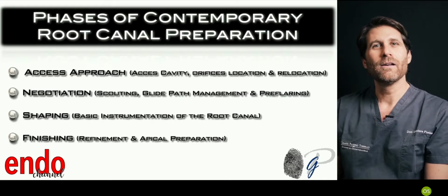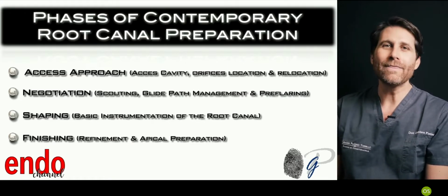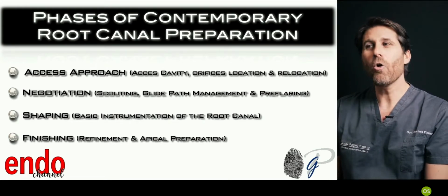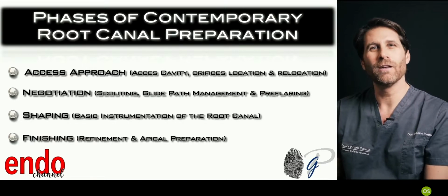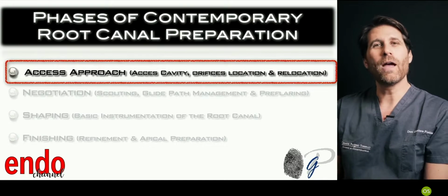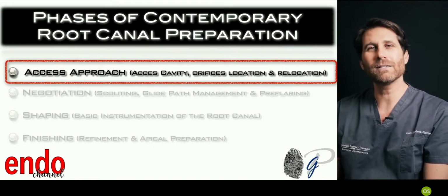Then there is the real shaping of the root canal with a basic instrumentation. And then the finishing, so the refinement and apical preparation. All these steps of the root canal preparation we will see through this journey in this project of the Endo channel. But first of all, we have to concentrate on the access to the root canal system, so the access approach.